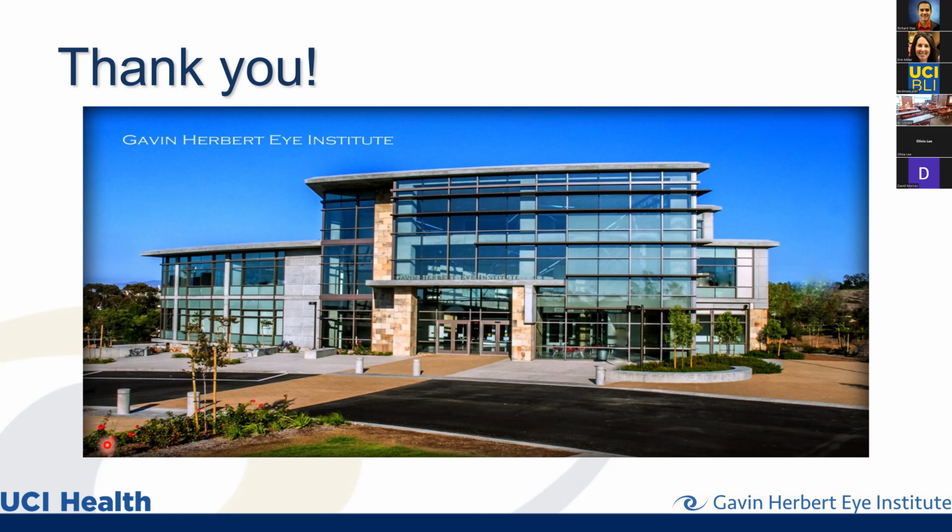There has been another group who's talked about doing an extensive mapping of the cornea to be able to put together an extensive view of the cornea and then know this spot corresponds to this spot before and after. I think while you could do that in theory, that means the patient's got to sit there for hours, and it's hard for the patient to comply with that. So it's true, there could be sampling error there.